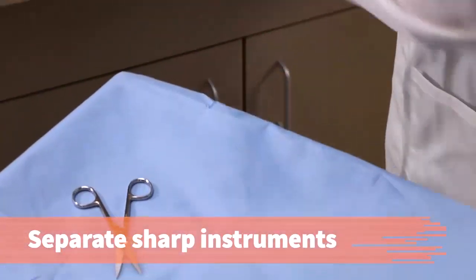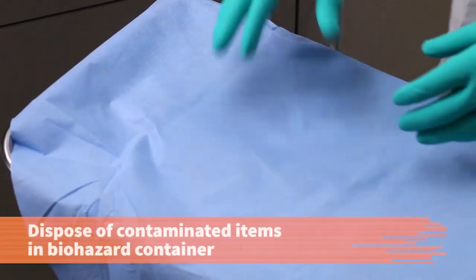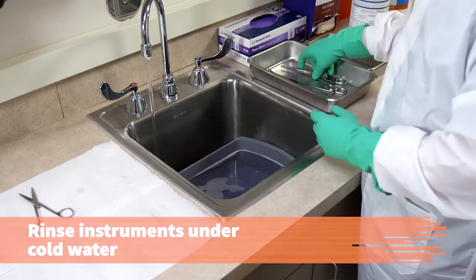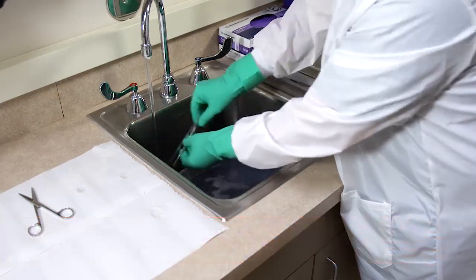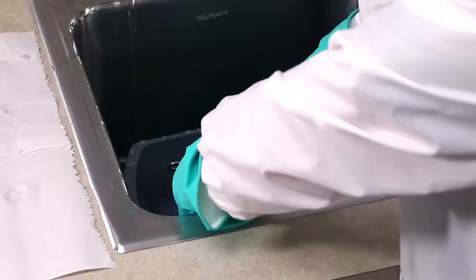To prevent injury and exposure to infectious matter, separate the sharp instruments from other instruments to be sanitized. Discard the sterile drape into a biohazard container. To help remove debris and prevent coagulation of body fluids, rinse the instruments under cold, running water. Never allow blood or other substances that can coagulate to dry on an instrument.